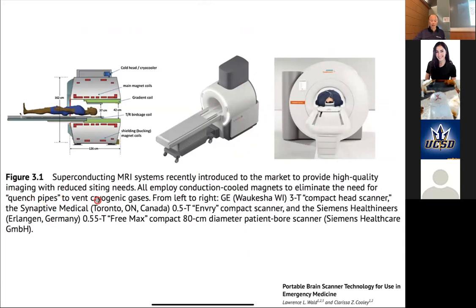For example, we could probably, without too much trouble, site one of these in this room, okay? We'd have to still add some shielding, but at least, since this is on the first floor, we don't have to worry about building venting for the helium to get out, okay?